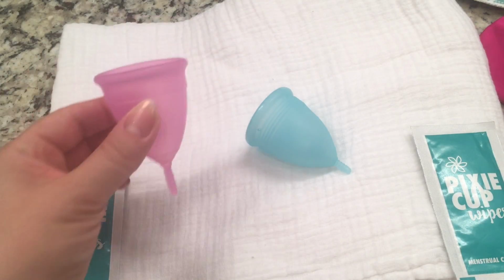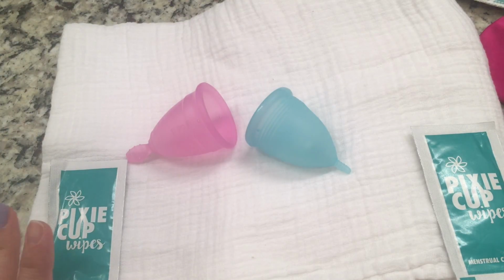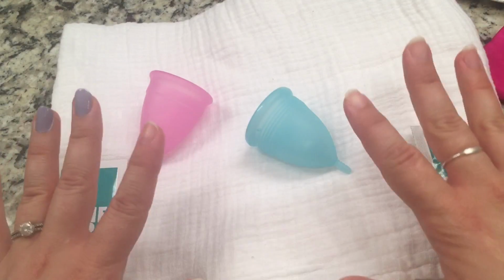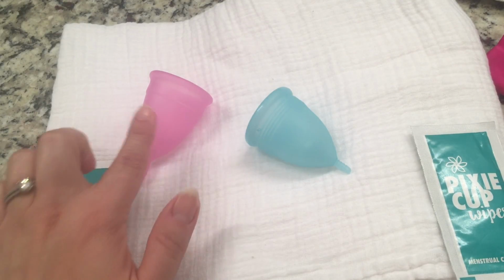These can be worn if you've got one that fits correctly, and I've tested it. You can wear it when you're swimming, when you're working out. I've got a friend who was asking about menstrual cups, and she was like, but I do like weightlifting and stuff. Like I'm afraid, I don't want to be doing squats and this thing pops out. If it fits you correctly, you might want to play around at home and do some stuff and kind of test it and make sure it's not going to move. But if it fits you properly and you've put it in properly, you can lay down and sleep. You can swim. You can do anything you could possibly think of, obviously, except have intercourse is the only thing you don't want to do.